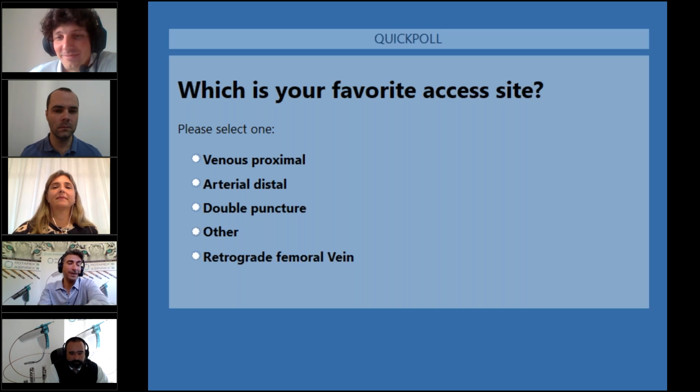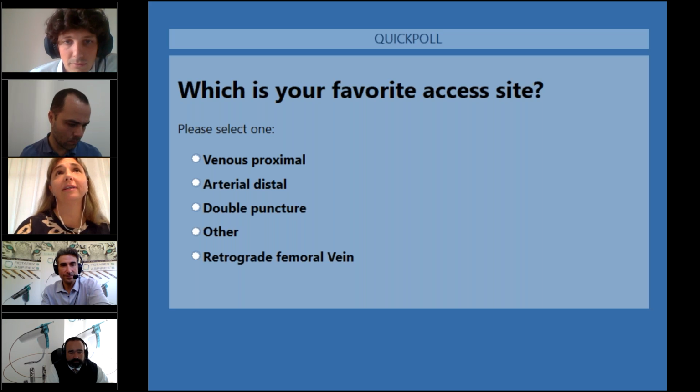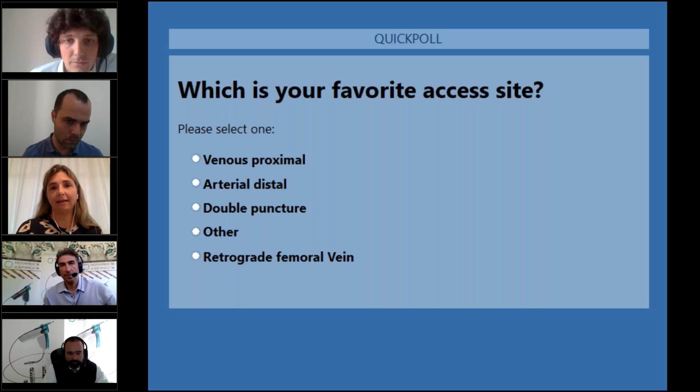And actually, we have another question. Thank you, Lorenzo, from the audience. When would peripheral venous access be your favorite option, Dr. Carlos and Professor Cristina? I don't understand peripheral venous access, but I'm going to try to answer. I usually use the outflow vein for access. That's my favorite. Other than that, as far as venous access is concerned, I can use the femoral vein.